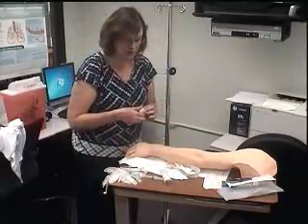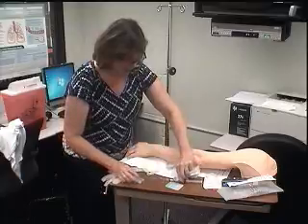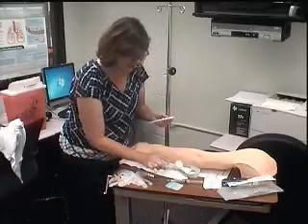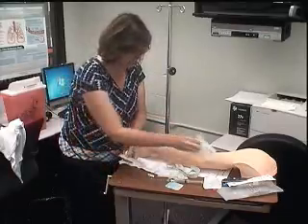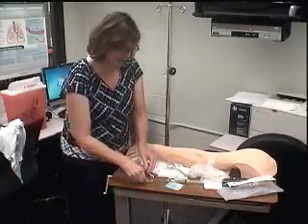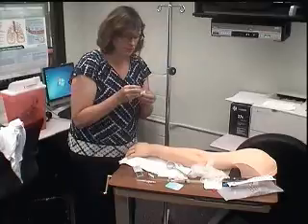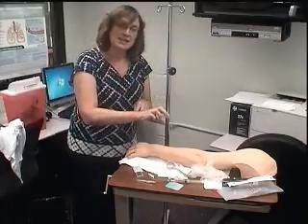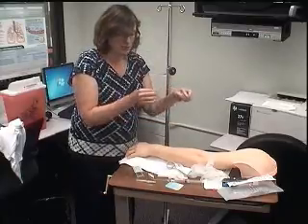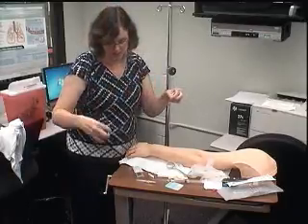So let me go ahead and get everything else ready real quick. I've got my dressing, I've got my saline lock primed, I've got my ChloraPrep to clean, and I've got my IV. I'm going to go ahead and tear tape. Make sure your table's clean. There's some controversy over whether you can put tape on the table. We're going to be putting the clear part of the dressing down first, close to the skin. You shouldn't be putting the tape next to the skin, so usually that's not an issue because your tape is on top, but still your table needs to be clean.